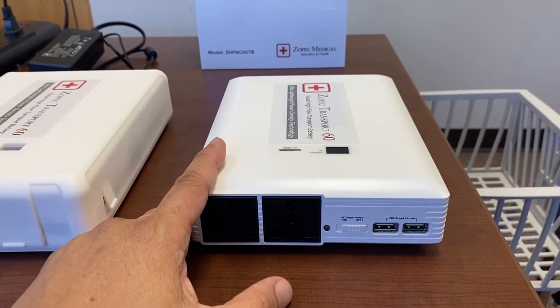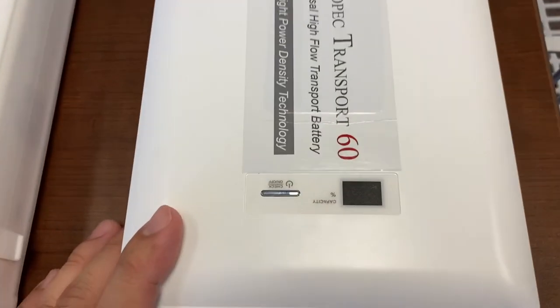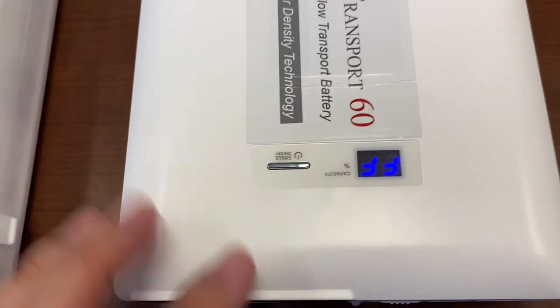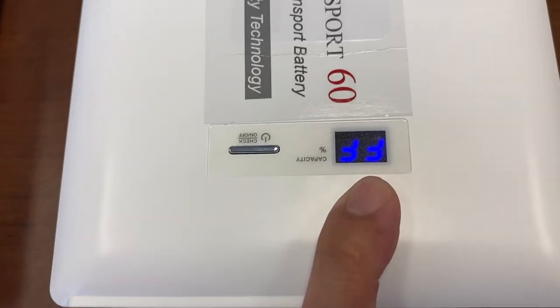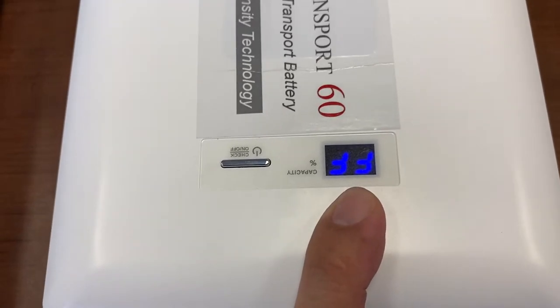So how do we use the battery? To turn it on, you just press and hold the power button and you'll see that FF shows up — that means full. I've charged it to 100% so it's full right now.